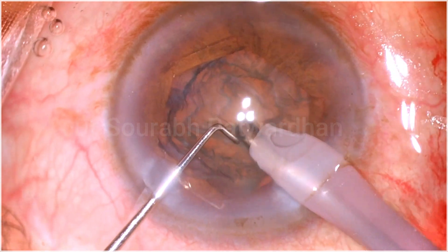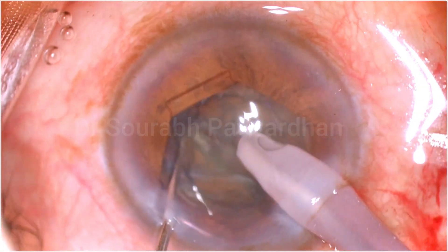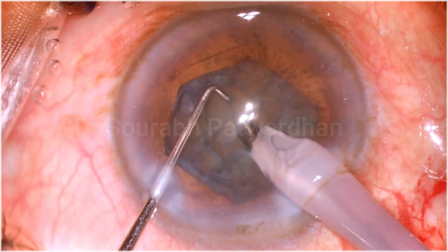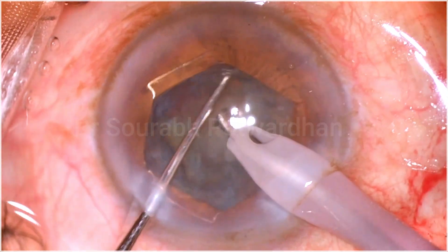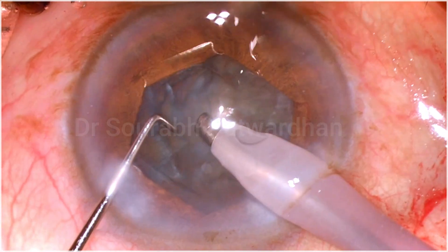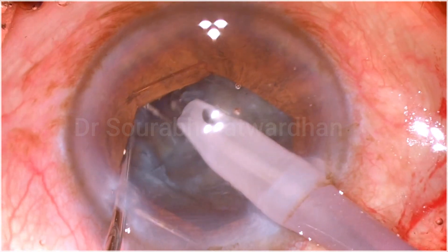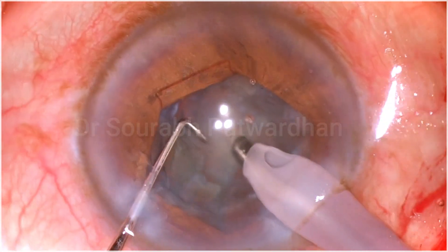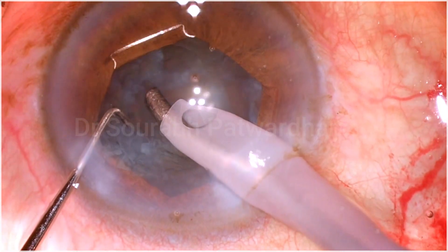It's a very soft, mushy kind of cataract where it's very difficult to chop. Probably here I would have avoided doing chop — I could manage a little bit, but the separation is not complete. In these softer cataracts, if we get a nice deep trench and separate the nucleus into two hemi-nuclei at the beginning, it makes things easier. Since I decided to do chops and was not getting a good hold because it's a soft grade cataract, I divided the nucleus but it was not complete. So I decided to go back to the most reliable technique of trench-and-divide. I made a deep trench and then divided the nucleus further.